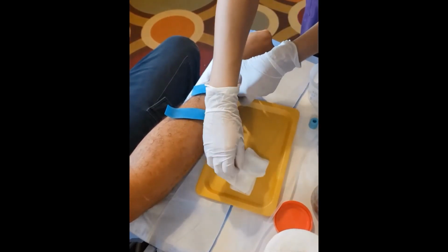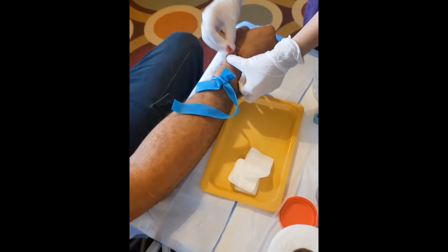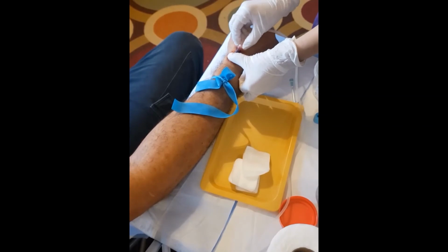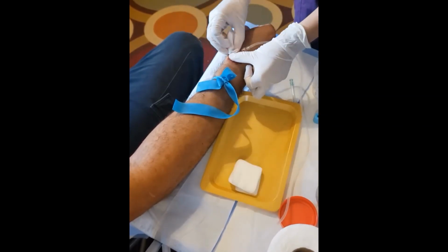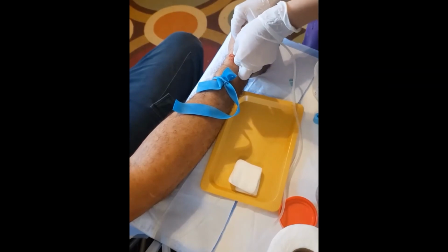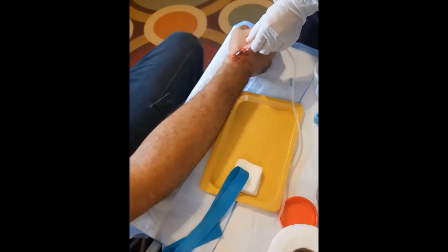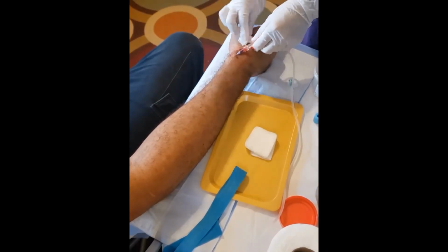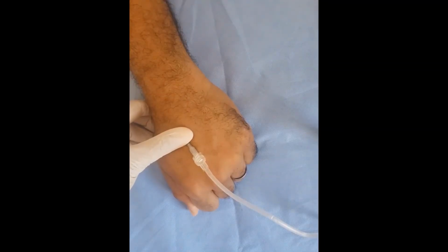In order to minimize the occurrence of overflow of blood, pinch a location where the cannula would end to block off the blood flow while you release the tourniquet and continue to collect your samples or connect your IV or heparin lock. Clean up the site of any spilled blood to ensure that moisture does not affect the adhesive on the tape. Be sure to always keep a keen eye on maintaining your intracath in place until you have secured it.